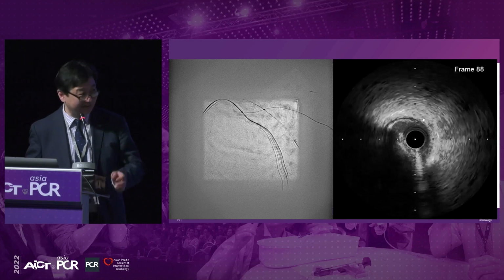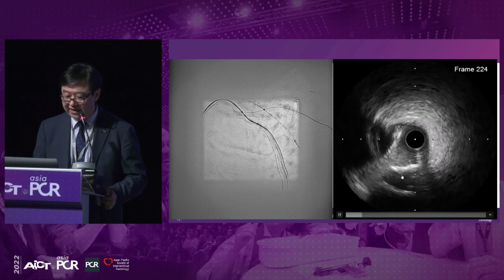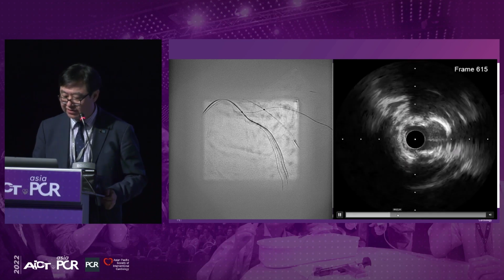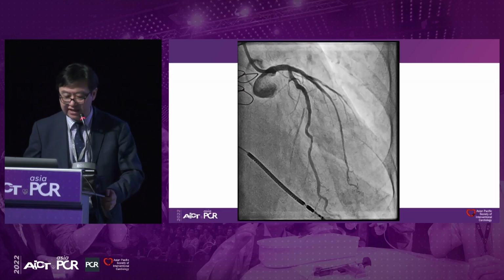We didn't change the settings of the ICD actually in this case, but we didn't have much trouble, and visibly we have modified the plaque on IVUS, which allowed us to see that it was very modified, and now we're able to stent it, and this is the stent result.